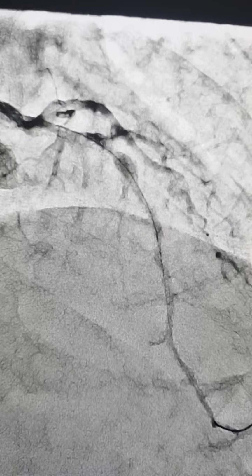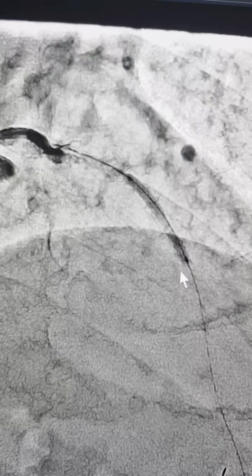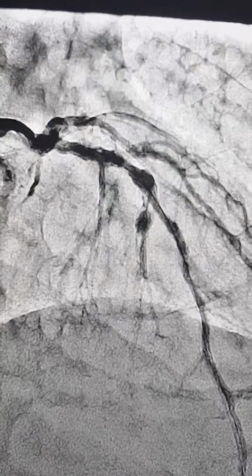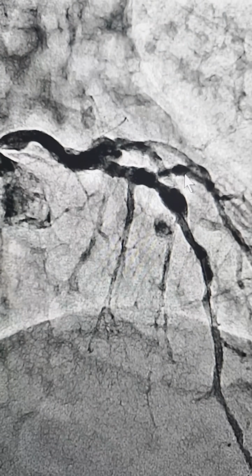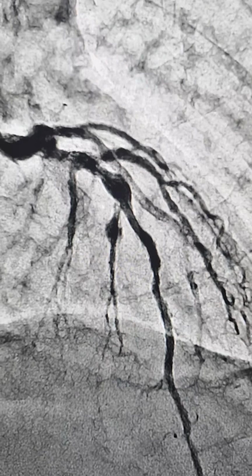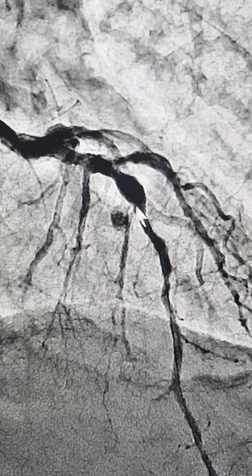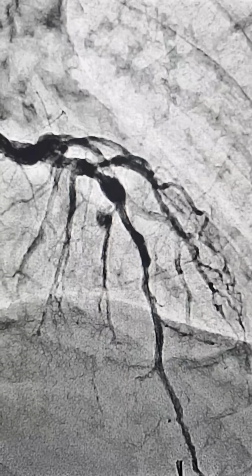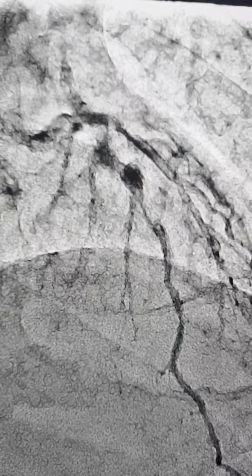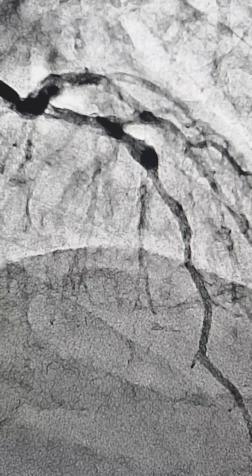We did a 2 millimeter balloon, and then a 2.5, and then we decided that we are going to put a drug-eluting balloon here. So we did a DEB here, with a couple of repetitions, and the result was acceptable. As you can see, the narrowing remains here, more mild to moderate. This was okay, 20-30% residual, but the area where we ballooned was okay, and nothing much to write home about. Maybe a bit of spasm distally, but the area that we ballooned and put a drug-eluting balloon was okay, and this is what we thought was the final result, and we left it as such. So the left main seemed alright, everything else seemed alright, and the procedure was simple, straightforward.